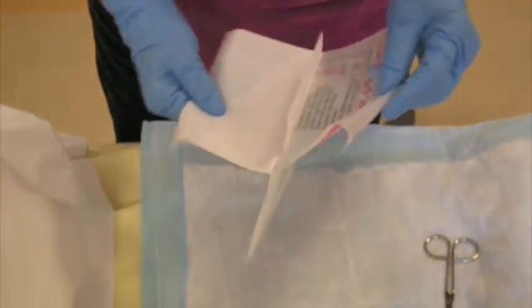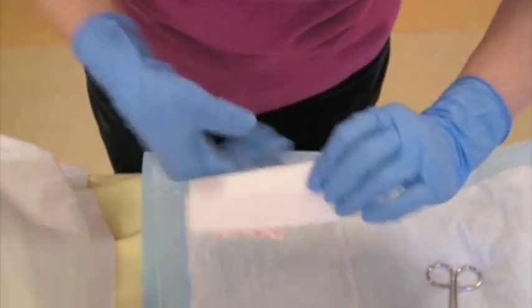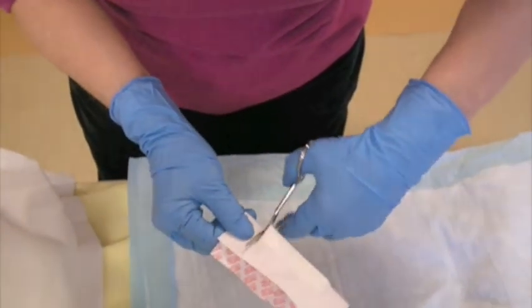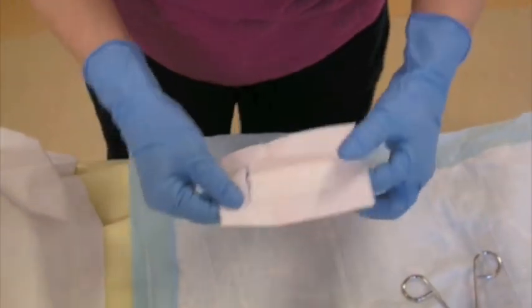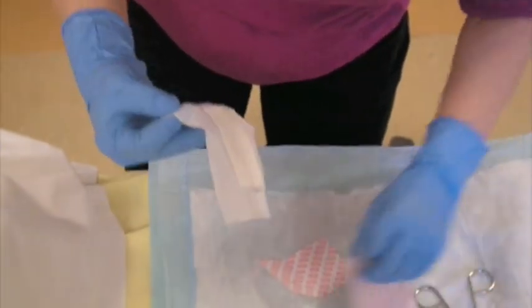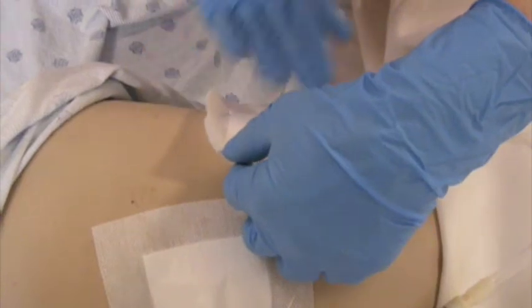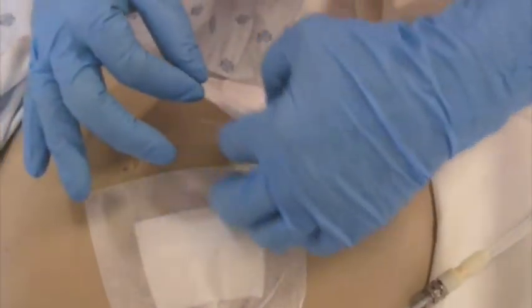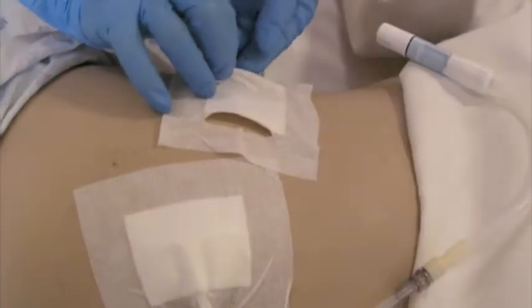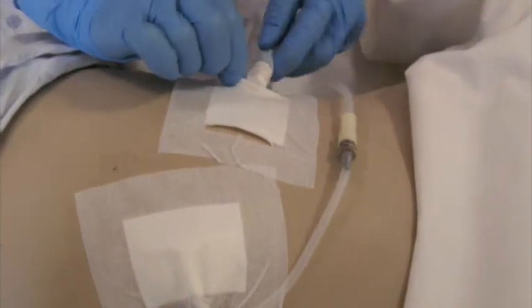At UHN, we use a second Metapore Plus Pad to create a pouch in order to prevent the catheter from dangling. You do this by folding the Metapore Plus Pad in half and cutting at the sides. Please keep in mind that this pouch only needs to be changed when needed. Ensure that the pouch is placed in a position that prevents the catheter from dangling. You may fold the sides in order to help with patient comfort. Then place your catheter in the pouch.